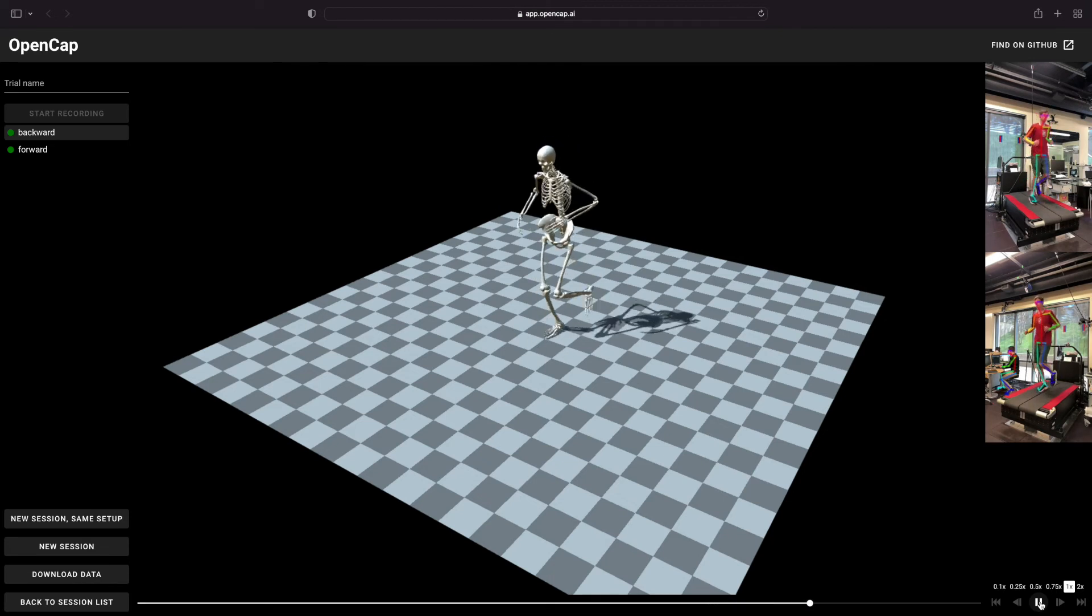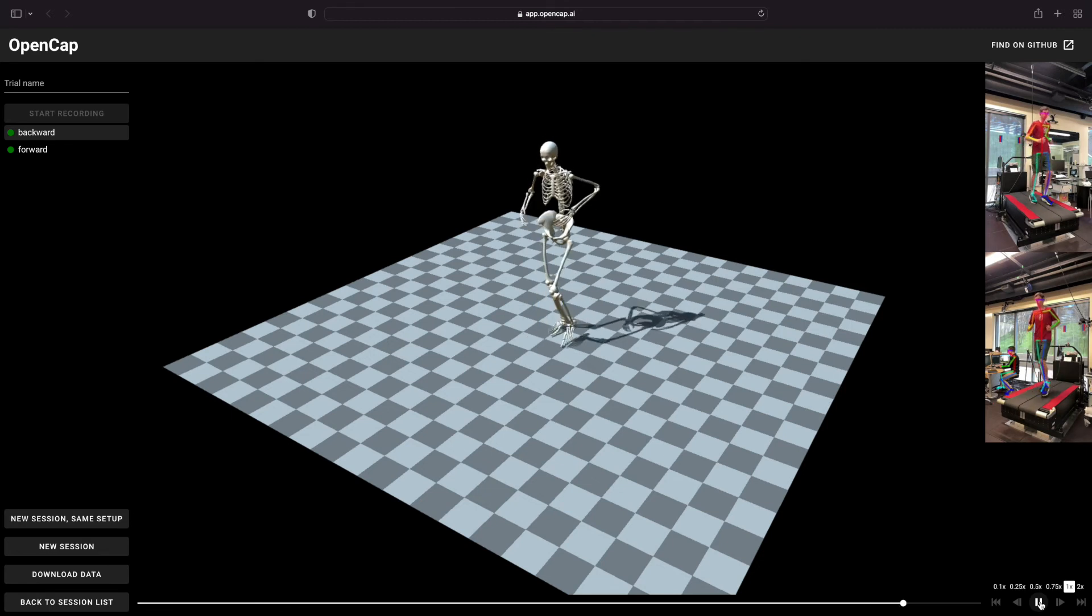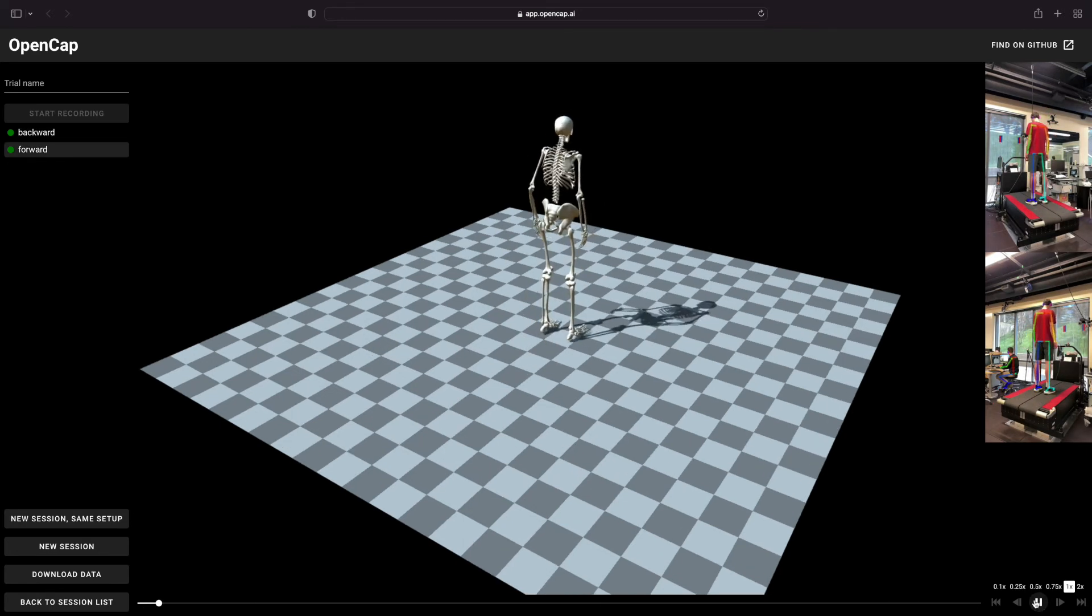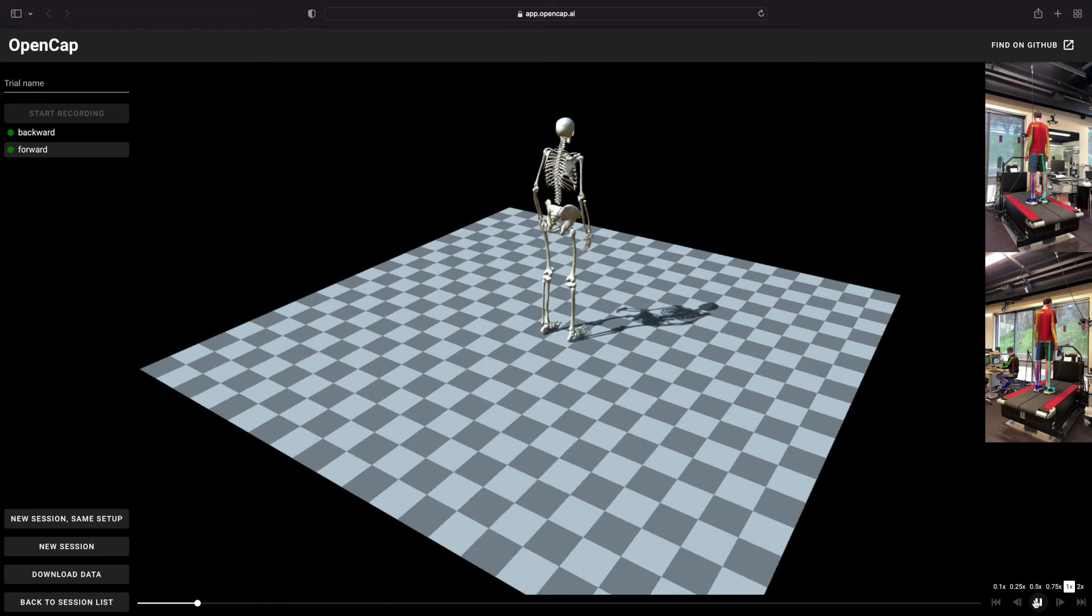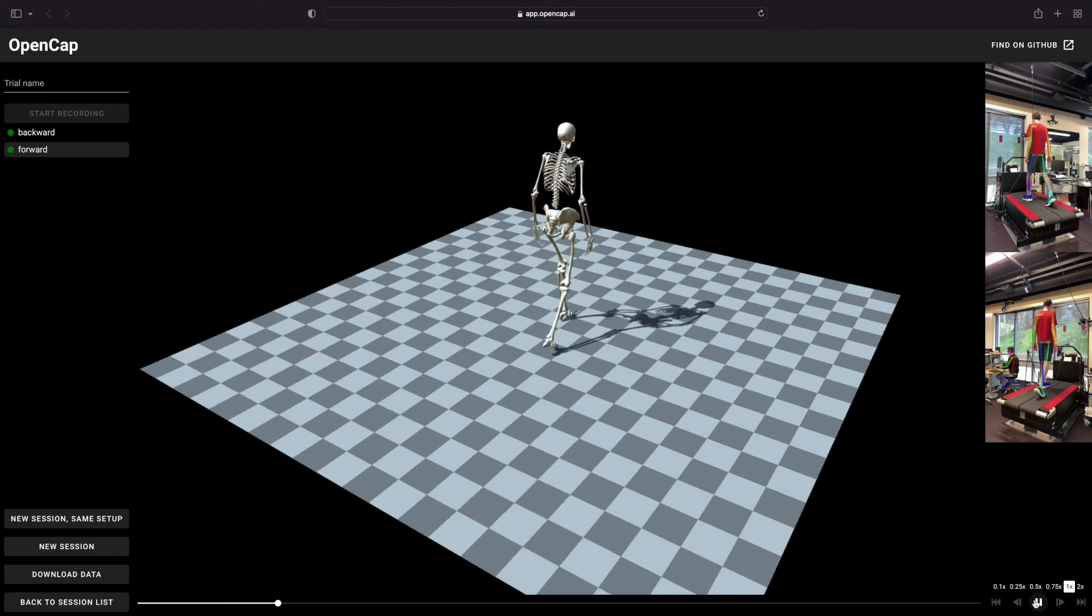You can then click on the trial on the left and visualize the kinematics in the viewer. You can drag the 3D viewer around to watch the kinematics from any angle.